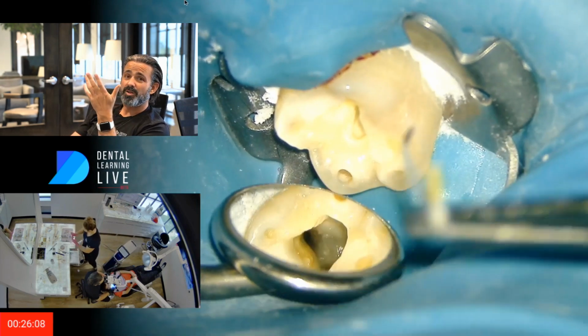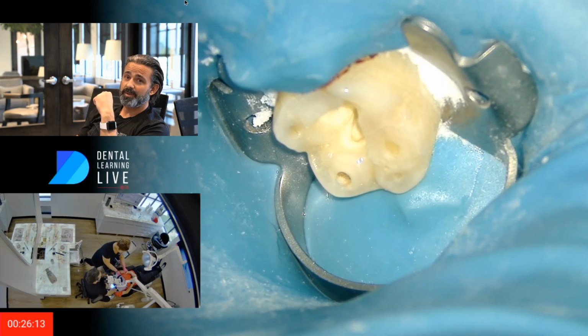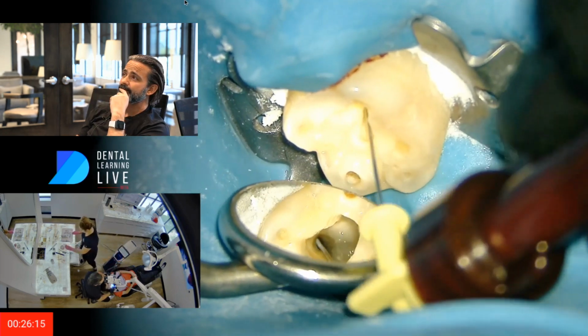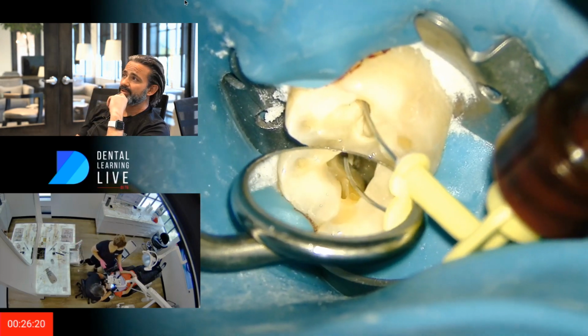So I've gone down to smaller cones. My master cone were a 30. Those are 20 paper points. And now I'm ready to obturate. Once I get it dry, I'm going to do these one at a time.